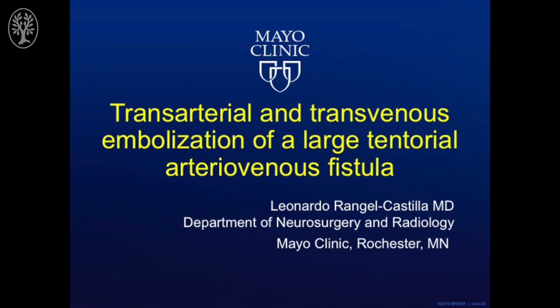Here we present a complex case of a patient with a large tentorial arteriovenous fistula that was embolized transarterially in combination with a transvenous approach.